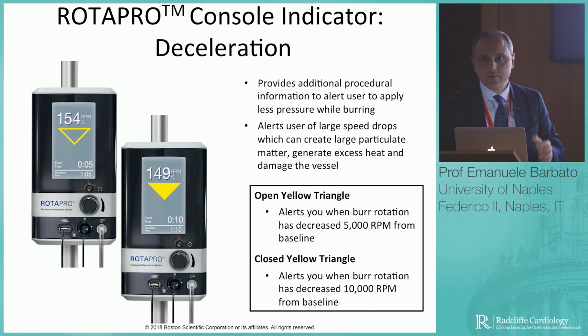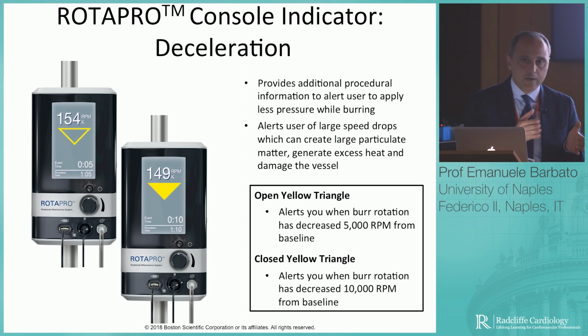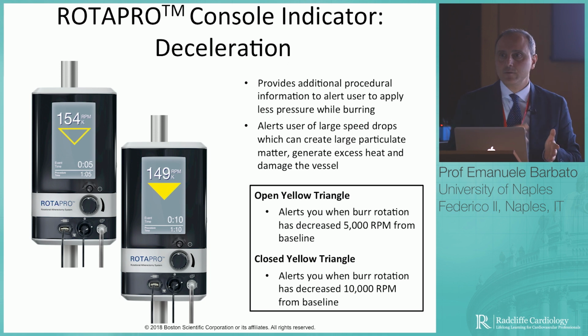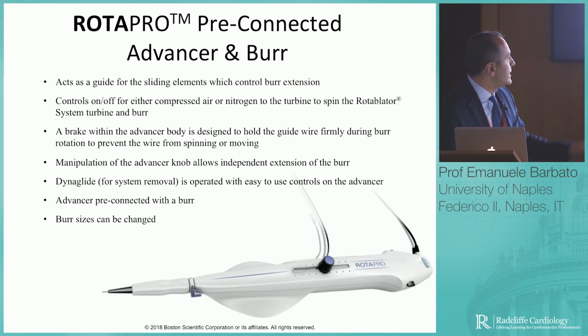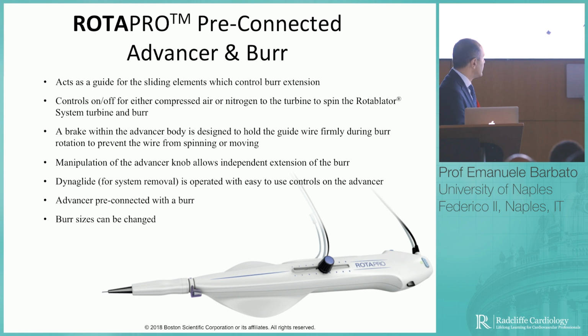So it gives you this information. But again, when you are in the middle of the procedure, I bet you will be looking at those images if you don't have someone next to you who keeps attention to it. The advancer has changed as well. It has become nicer in a way. What the pedal did is just here now on the knob.